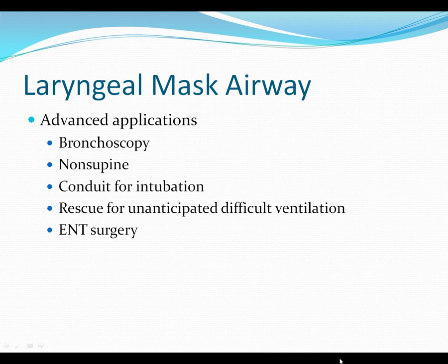So it's a nice way to introduce a bronchoscope. Has anyone put a bronchoscope through an LMA? It's a nice big hole, so it's easy to put the bronchoscope through, and usually by the time you get to the end of the LMA, you're looking at cords, and you can just go right in and do whatever you want to do, if you want to intubate or whatever.